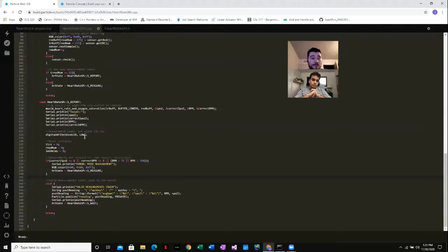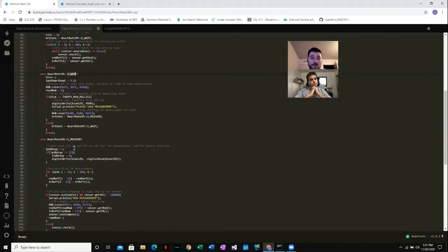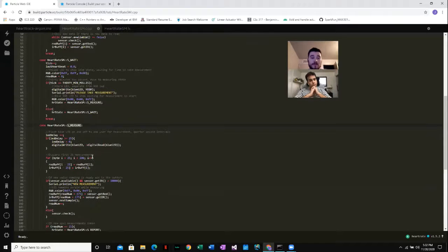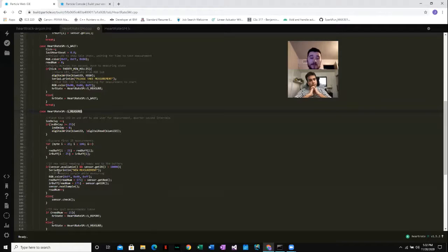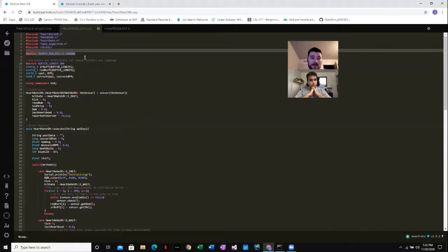And here's a quick look at our state machine. We are using a state-based system. We have an initialization state, a waiting state where that LED is yellow, waiting for a measurement. The measure state, as I had mentioned here: if the RGB LED is blue, then the measurement process has not started. If the RGB LED becomes purple, that means the measurement process has started, and to keep your finger on the device. Once the device goes back to yellow, the flashing blue LED will stop, and that means it's waiting for another measurement. You'll see up here I did set the millisecond threshold back to 30, but for this purpose it was set to 5 so that we could quickly push a couple of readings to the server.